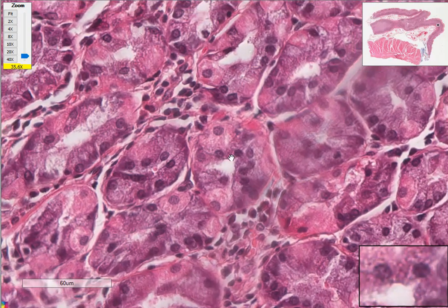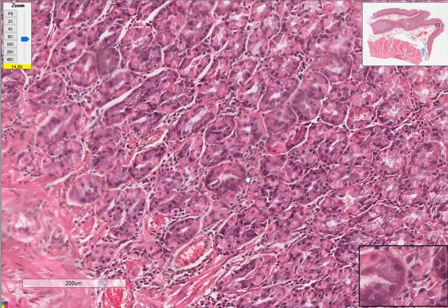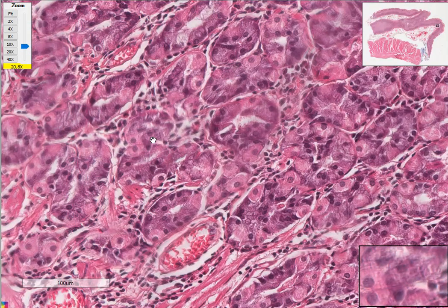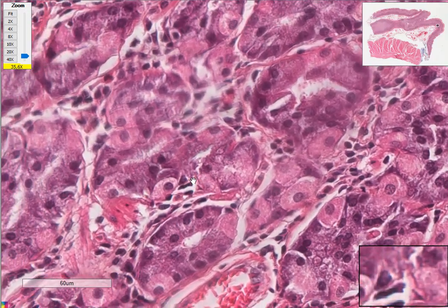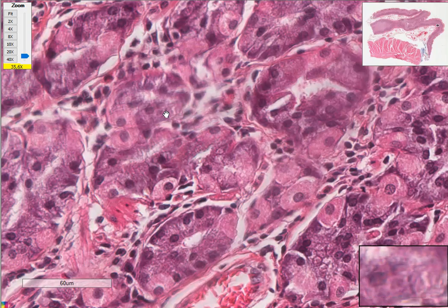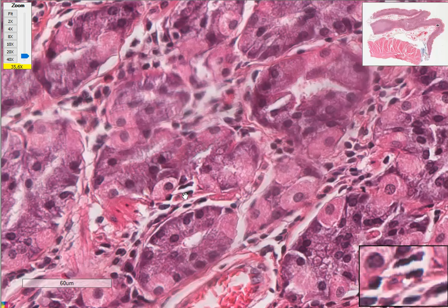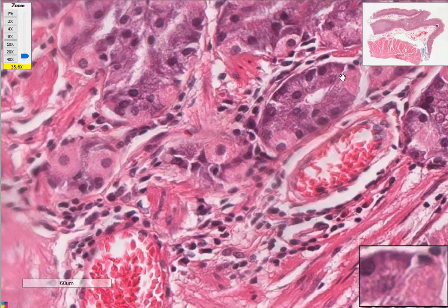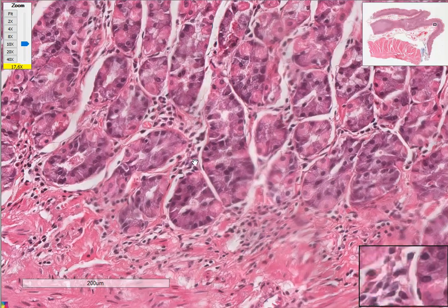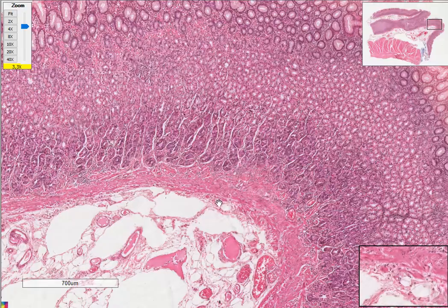Okay, so as we now go deeper, this is a parietal cell, just a quick one. Parietal cell, chief cell. This is a nice slide. So parietal cell, chief cell, enteroendocrine cell. You can see the cytoplasm is almost getting cleared. If I could just find a nice enteroendocrine cell for you, I think I would be very happy. Okay, but anyway, I'll pick up one as we go forth.